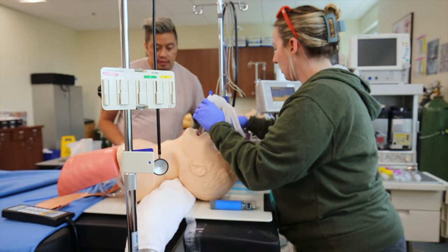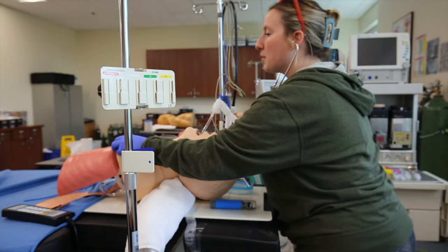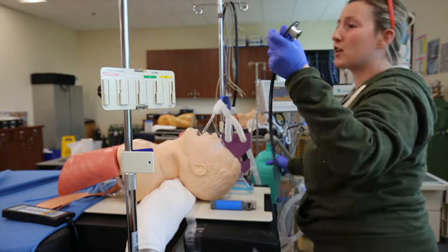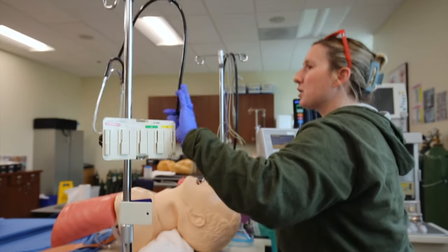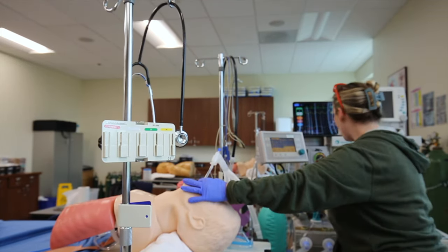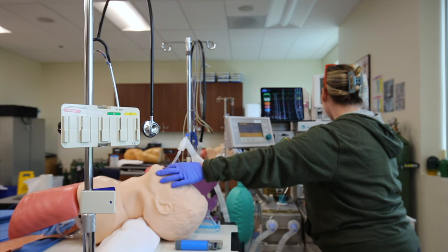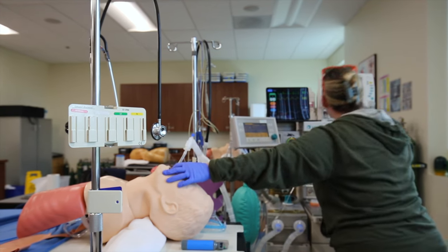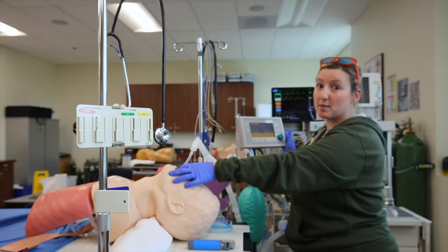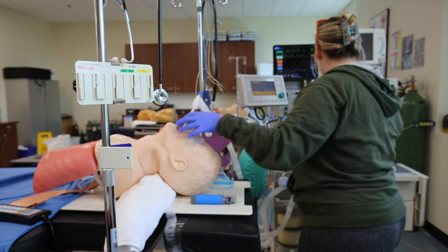We're still in bag mode and we're going to check placement. Bilateral breath sounds — positive. Negative epigastric. After a couple of breaths I should have a good end-tidal waveform, and I'm looking for misting in the tube as well. At this point I'm going to switch to vent mode, open my APL valve, turn my flows down to 2 liters, and turn my SEVO on. Cycling back to my monitors — cycle a blood pressure — and checking the vent to make sure the patient is getting adequate volumes and pressures aren't too high.